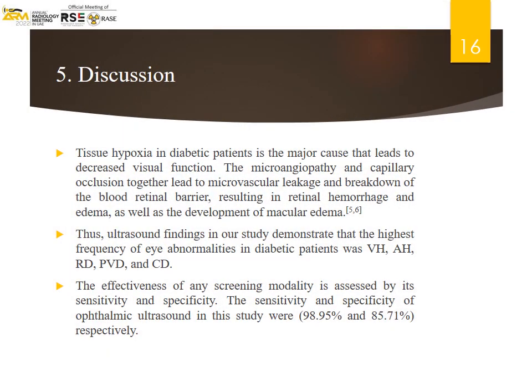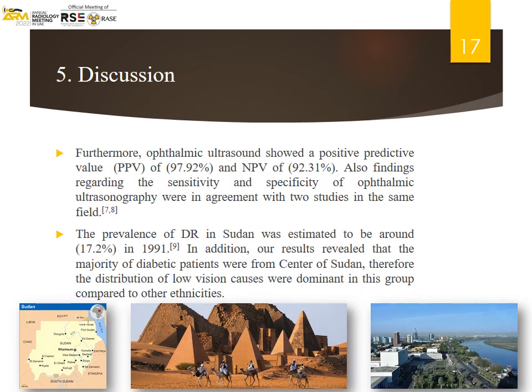The following facts can be provided as part of a discussion of the study's findings. The sensitivity and specificity of any screening technique are used to determine its effectiveness. In this investigation, the sensitivity and specificity of ocular ultrasonography were 98.95% and 85.71% respectively. Sudan had 17.2% diabetic retinopathy in 1991.